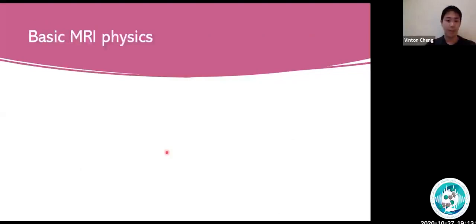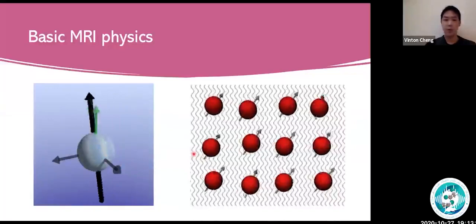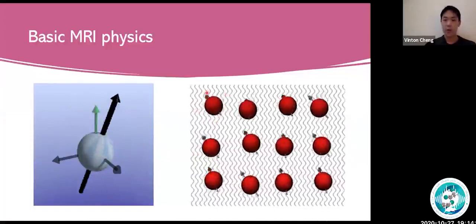So, you probably are all aware of this, but I think it's worth going over, mainly for my benefit, because I'm not a physicist. MRI physics relies very much on protons. Protons are abundant in our body, particularly in water, and the brain in particular is largely composed of water, so obviously this makes MRI a very powerful tool to image the brain. MRI relies on what we call proton spin. Every proton rotates on an axis and has a level of spin. In the tissue, multiple protons exist, and between tissue compartments, depending on the chemical composition of the tissue, the spin will be different, and also depending on other aspects such as the size of the molecules and, for example, the fatty content.